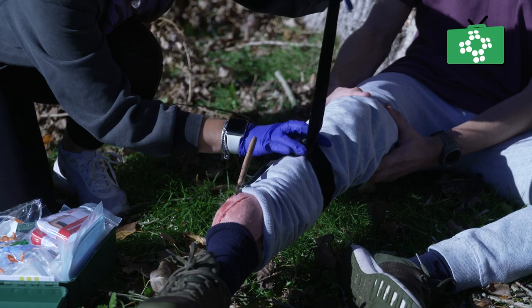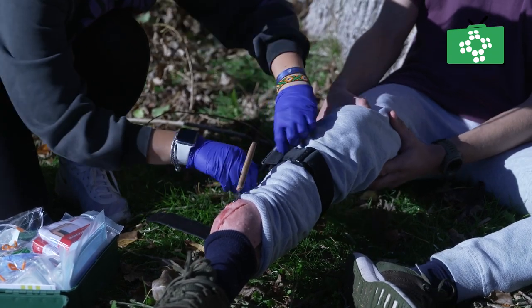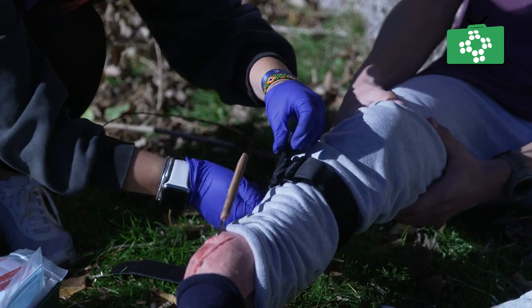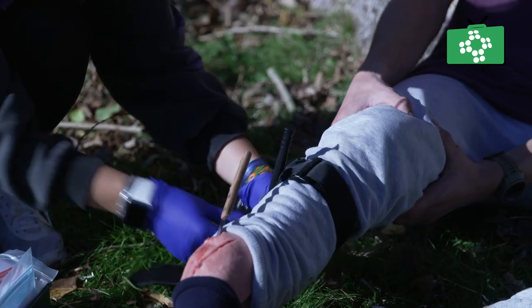You must not apply the tourniquet over a wound or over a joint. Secure it in the holder and note the time it was applied, as the emergency medical services will need to know how long the tourniquet has been applied for.